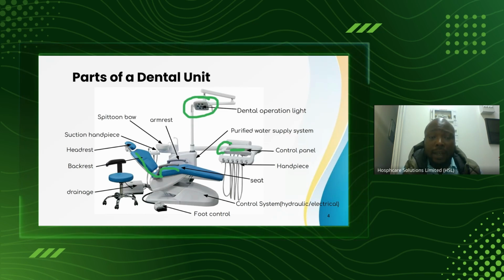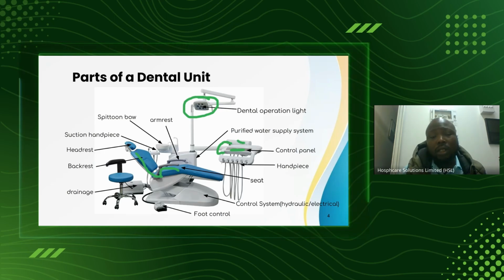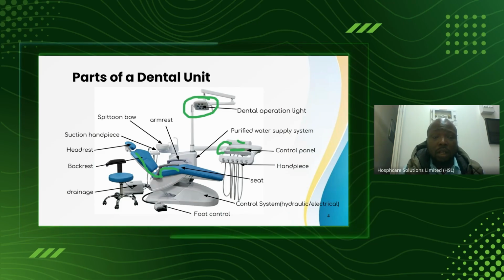At the far end here, we have what we call the X-ray viewer. Upon taking the X-ray film, this is where the dentist views the images. If you come down here, we have what we call the foot pedal. Ordinarily, the foot pedal activates the functionality of the handpieces, the turbines here.